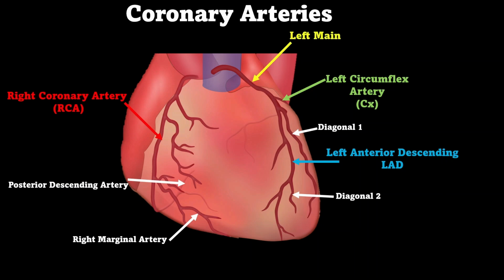And then we finally talk about our left main. My left main is kind of where AVR is looking. And that is going to be the end of our 12-lead interpretation lecture.